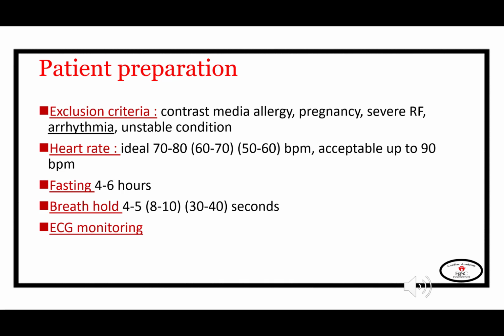The heart rate, the lower the better. It's ideal now with the new generation machines to have a heart rate of 70 to 80. This is a major improvement compared to the previous generations, which required low heart rates of around 60 beats per minute.